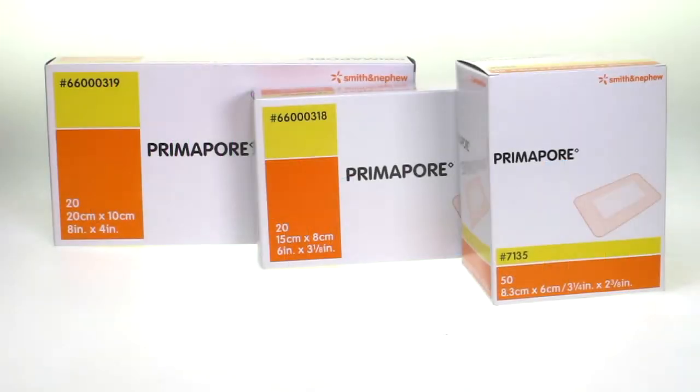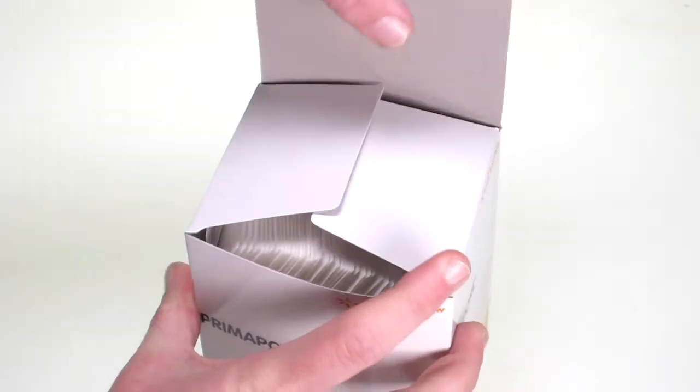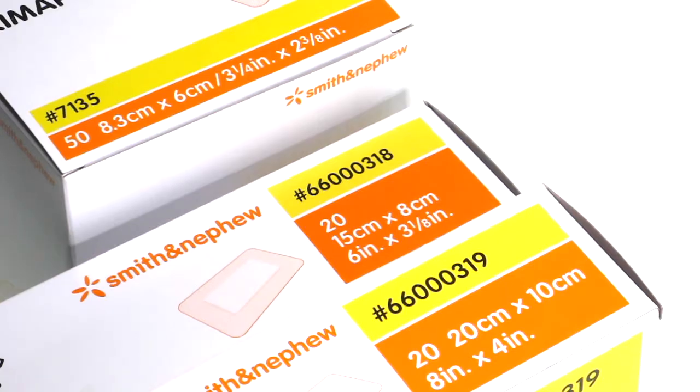Hello, I'm Lewis and we are looking at our range of Smith and Nephew Primapore wound dressings, popular in both New Zealand and Australia and available in boxes of 20 or 50.